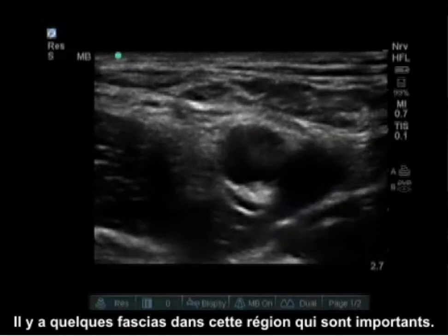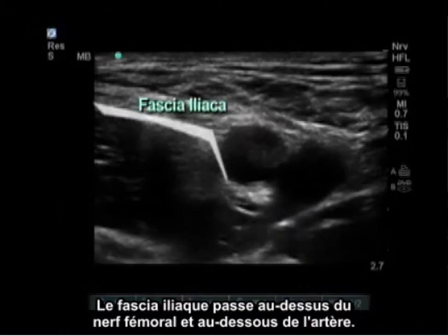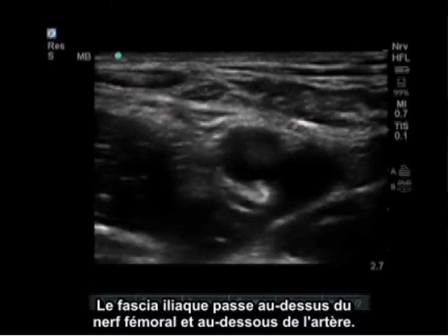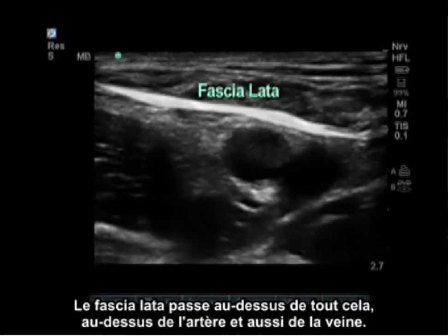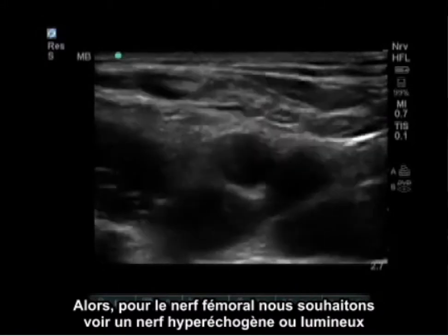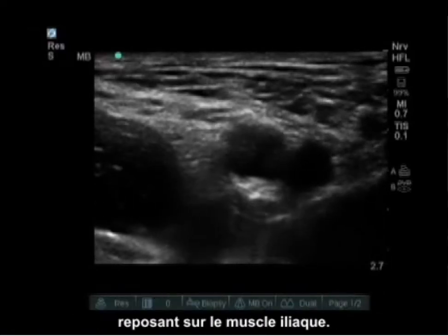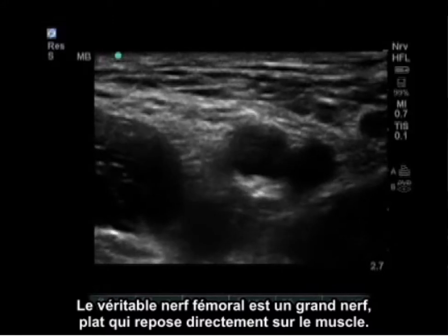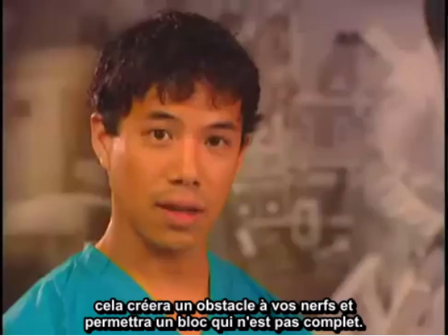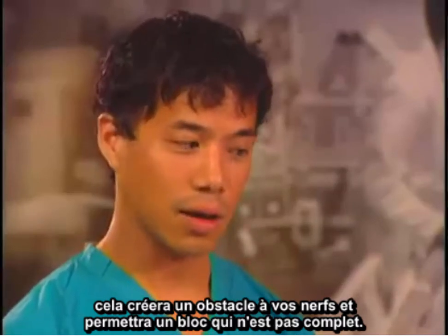There are a few fascia coverings in this area that are important. The fascia iliaca runs above the femoral nerve and below the artery. The fascia lata runs above all of this, above the artery and vein as well. For the femoral nerve, we want to see a hyperechoic or bright nerve sitting on the iliacus muscle. The true femoral nerve is a wide, flat nerve laying directly on the muscle. If you inject above the fascia iliaca, this will create a barrier to your nerve and allow a block that is not complete.